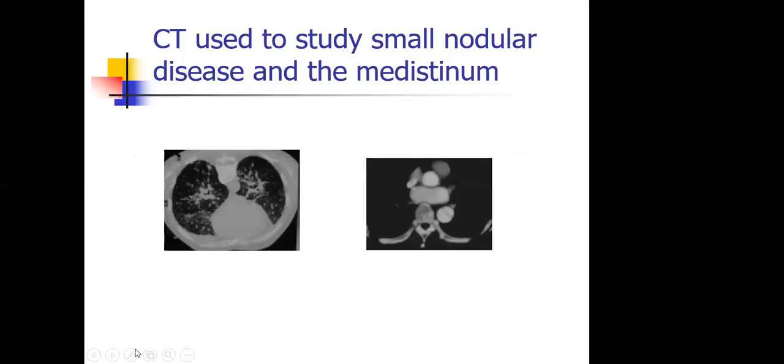So back to our presentation here. We have already looked at the indications and the sets of images that you may have. In addition to these two, you may also be provided with bone windows, especially if there are problems noted in there.